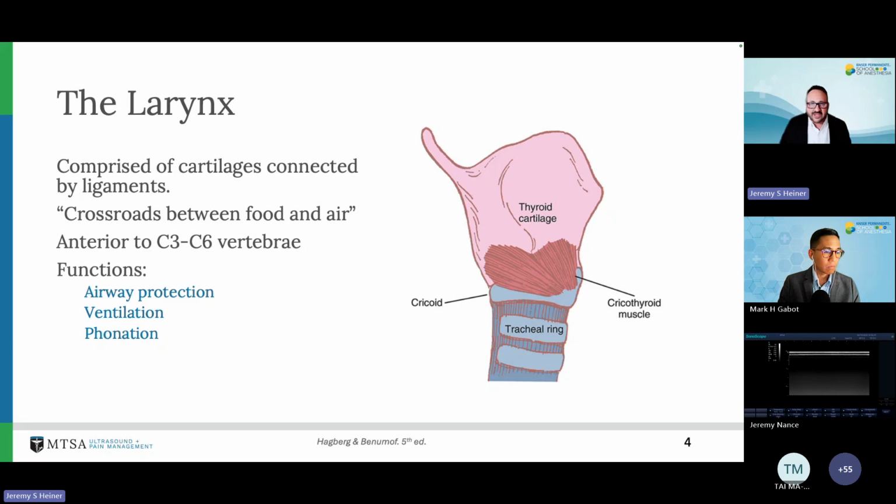If you're in the ER, you can get that. If you're in the ICU, you can get that. If you're having trouble getting a scalpel, open a central line kit. Bougies are available, 6-0 endotracheal tubes are available, and certainly in the OR, we have that equipment. It's easy to get, and people know what they're looking for when you ask for those 3 things.